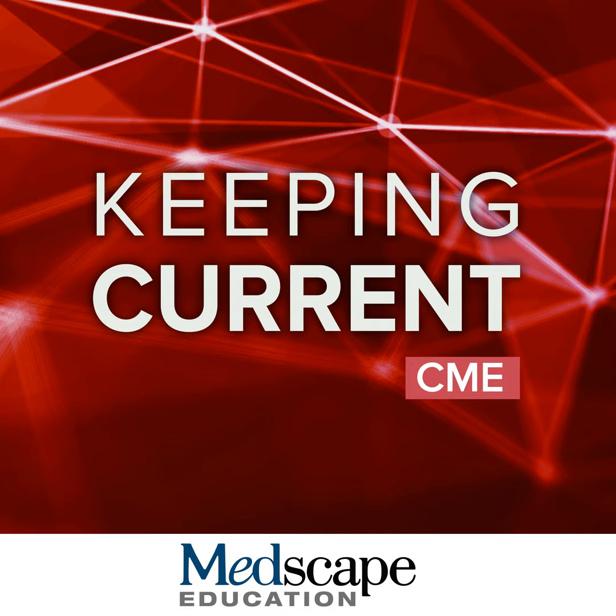We use them for patients with a brain tumor. We use them in different settings. Sometimes perfusion imaging is helpful to differentiate between a brain tumor and a brain tumor mimic. Example, you can sometimes have tumefactive multiple sclerosis plaque that may very well look like tumor on the conventional imaging, but they look very different from a brain tumor on perfusion imaging.